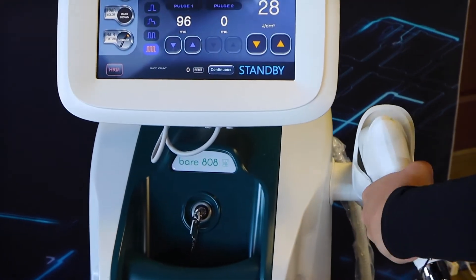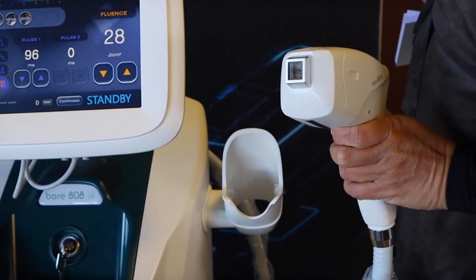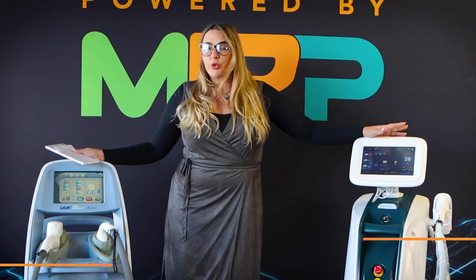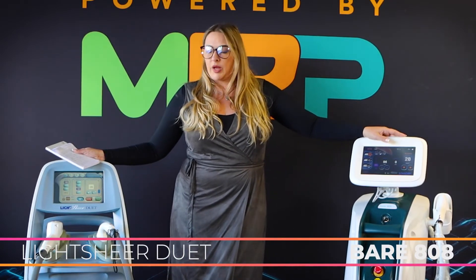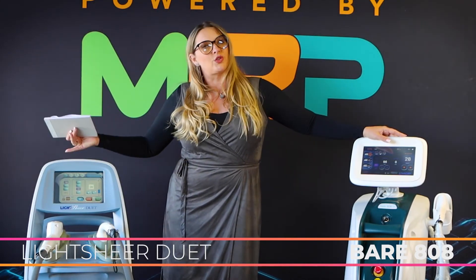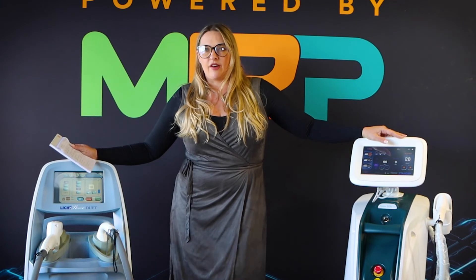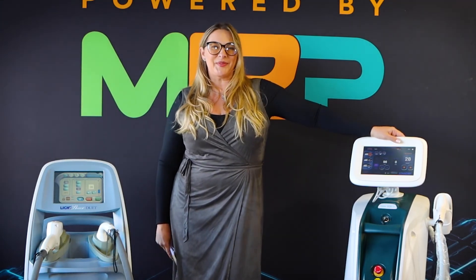The Bare 808 handpiece has a nice configuration with a 14 by 14 millimeter spot size — a little bit bigger, very comfortable, and not too heavy. Both are great devices. The Bare 808 is brand new, sitting around $40K, whereas the LightSheer Duet is an older model available used and refurbished, ranging anywhere between $14,000 and $22,000 on average. And that is your comparison for both diode systems. Have a great day.